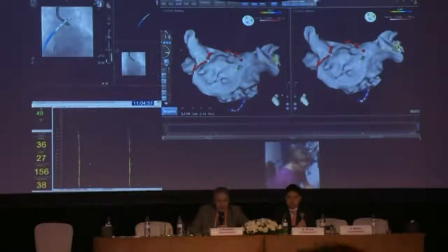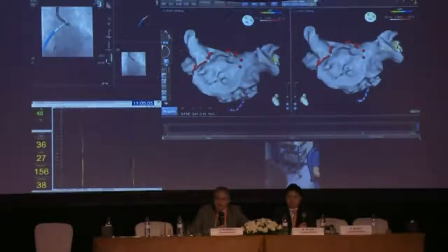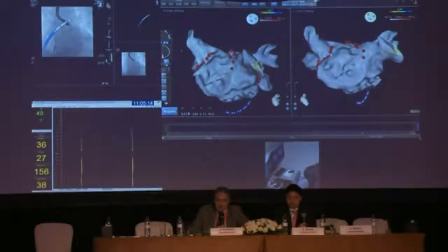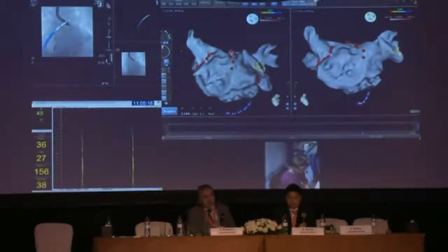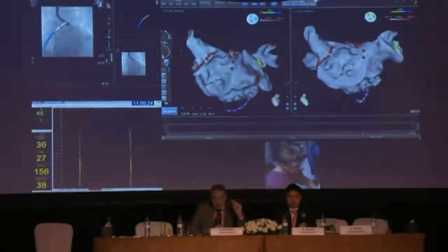But anyway, now you have sinus rhythm, so how will you continue? Will you do some line in the roof or in coronary sinus, some ablation, or what will be the strategy now? So my strategy is to do nothing more. I'm going to check the veins and make sure they're isolated, but I'm a real believer that the more you do, the more substrate you create. We've ablated him to sinus rhythm, so we've hit the substrate that's relevant on the day, and I think the likeliest reason for recurrence is either reconnection of the veins or failure of one of the lesions that I've done, the CFE, and I really don't want to add anything more to him now.